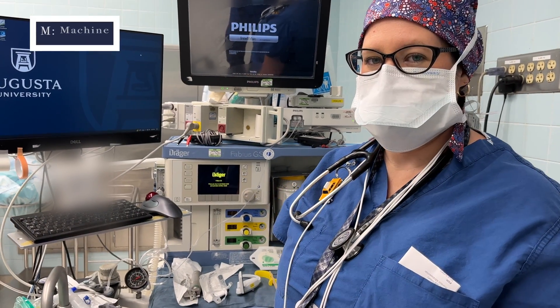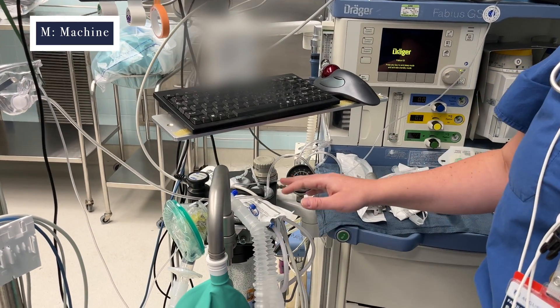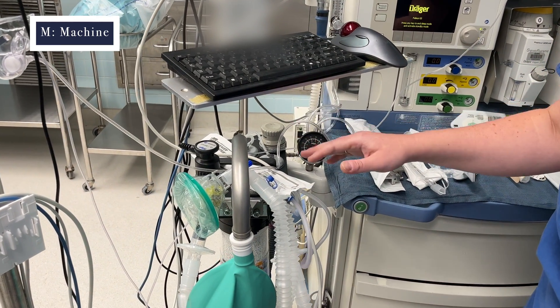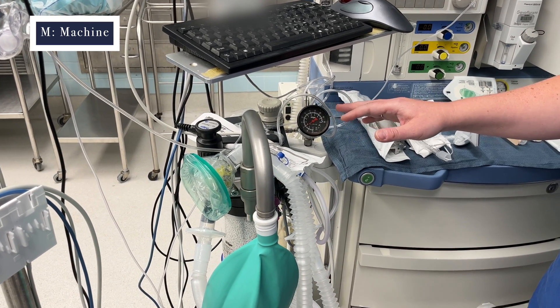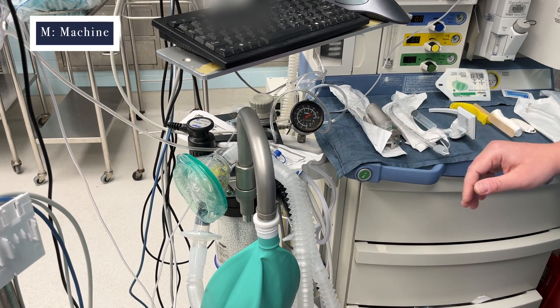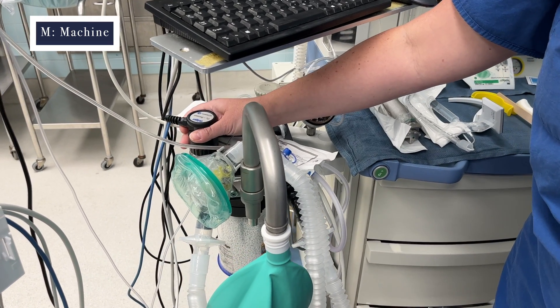To get started, you would first start with the letter M, which stands for machine check. Basically you want to run through a couple of safety checks on your anesthesia machine to be sure it's ready to go for the day. There are a couple of different machines that may have different setups.